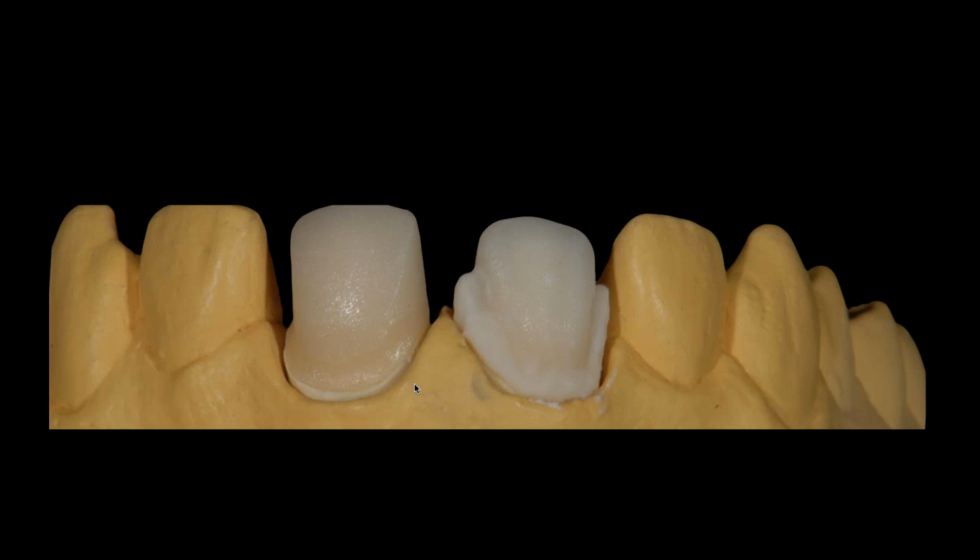So think about what's going to happen. Now let's kind of walk through this, because this is kind of the meat of what I wanted to explain to you in this lecture after rambling through all the other stuff. I think the opacity on the inside is really king. And whether you do it the way I do it with fluorescent materials, margin materials, or liners is one option. But another option that a lot of people tend to use is really just understanding how to create more opacity inside. And I want to show you why it's so important.